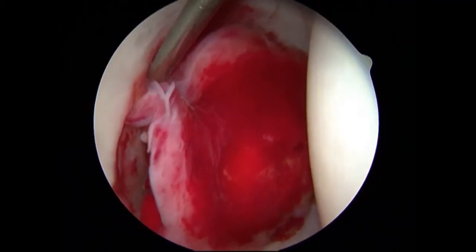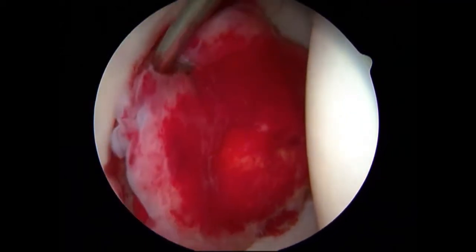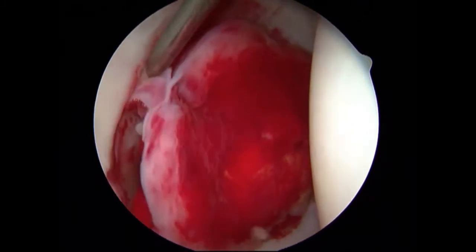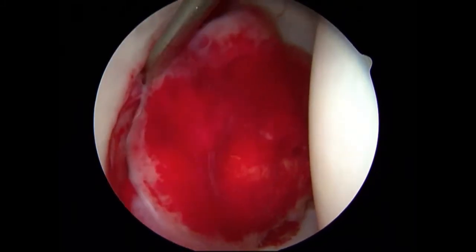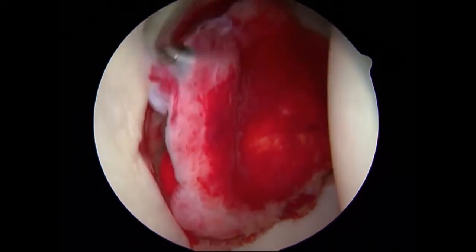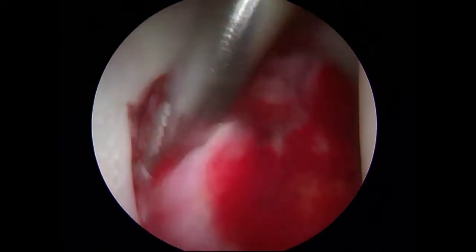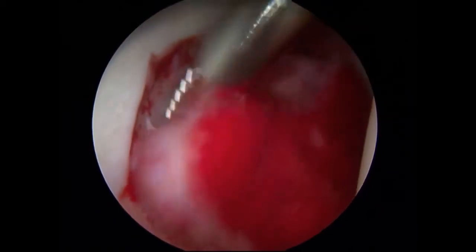This collegiate female soccer player has a nonspecific inflammatory synovitis emanating from the pulvinar tissue within the acetabular fossa. These types of lesions can be a significant source of pain due to the dense nociceptive neural innervation of this tissue.